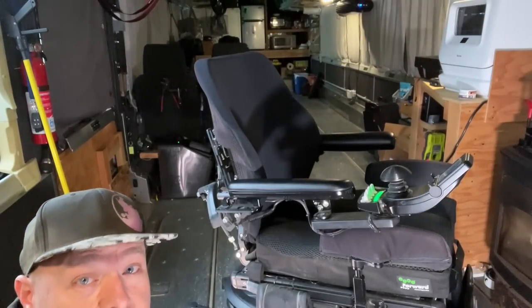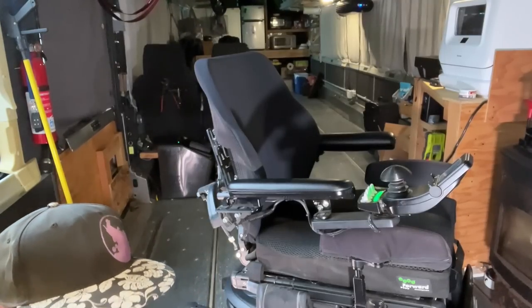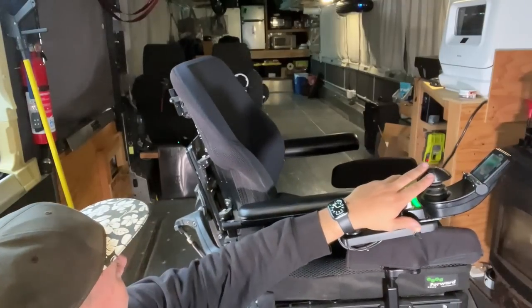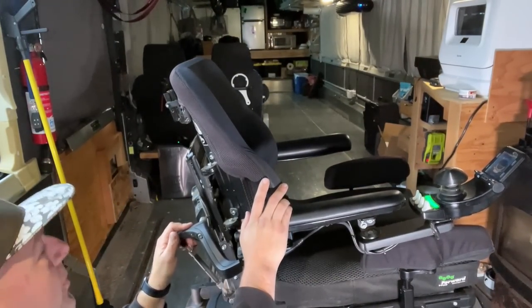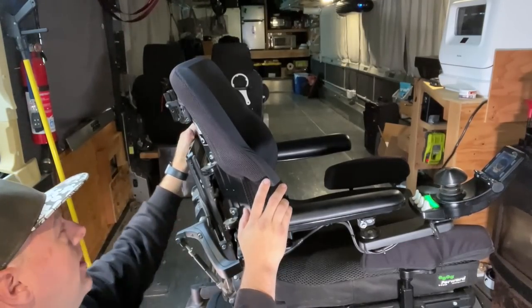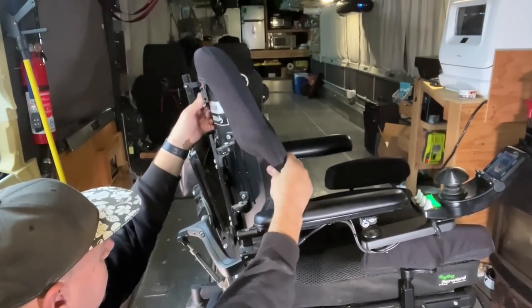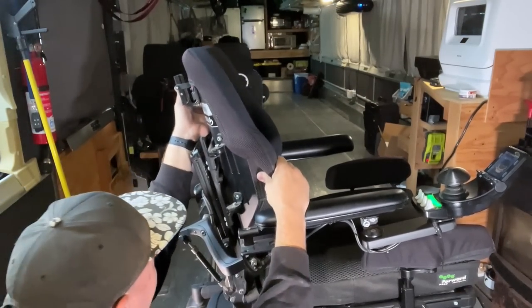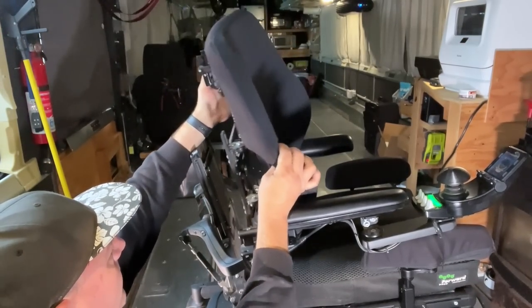My plan here is I'm only getting on the floor once, so in theory we should be able to do all of this. I have all my tools right here. Removing the seat backs from these direct backrest adapters is pretty easy. There's a little latch over here and you just flip that. A more able-bodied person would find this easier, but this whole thing just comes right off.